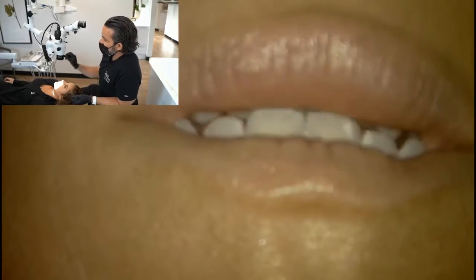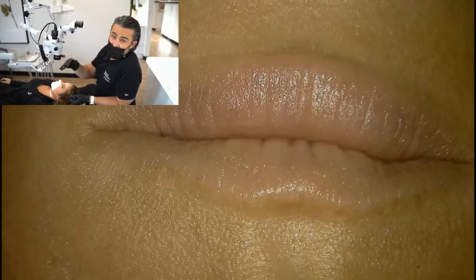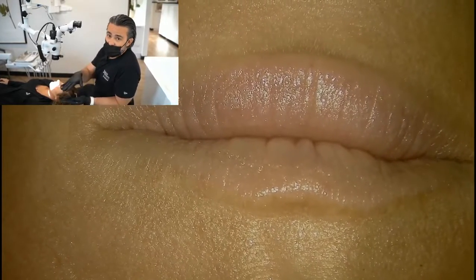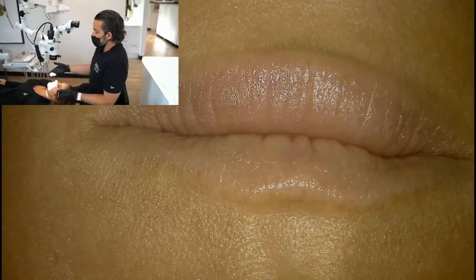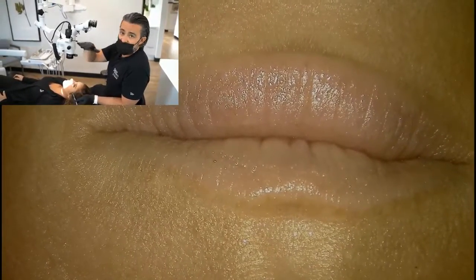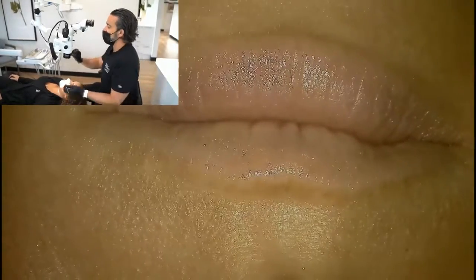And this fine focus is also very important, because as you are higher up at a higher magnification, you actually have a smaller depth of field to stay in focus. So when you go from the anterior to the posterior, or the mesial to distal in the mouth, that depth shrinks as you magnify. And so you'll find yourself doing little fine focus like this.